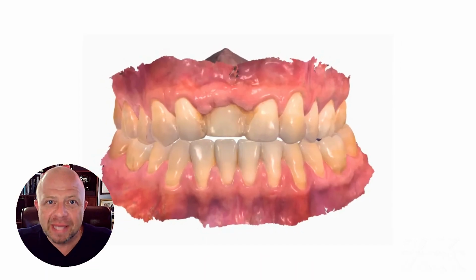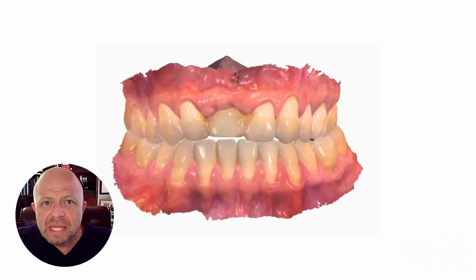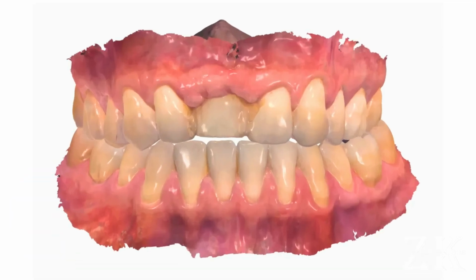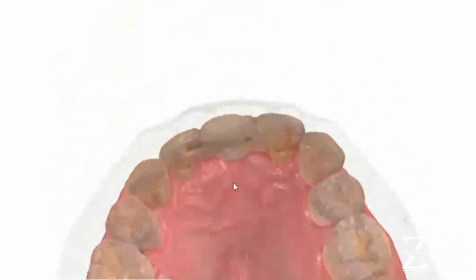I can actually scan somebody's mouth and take a look at a 3D model of what's going on. Let's take a look a little closer here. Our patient was born with 2 large laterals and only 1 central, or maybe there were 2, but the teeth moved in. As you can see, he's in a crossbite. Look at the gum here. It's overgrown, and whoever his dentist was tried to actually build up a tooth inside.